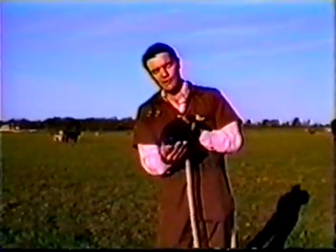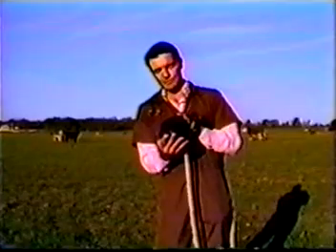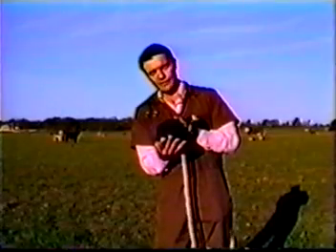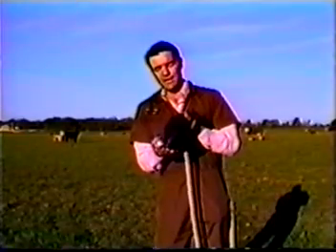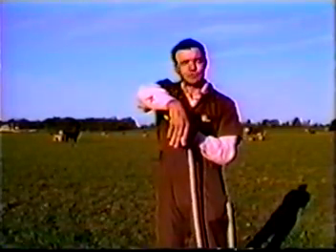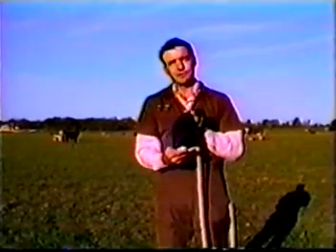Oftentimes I will put pressure upward into the gravid uterus, trying to get a little closer to the fetus. I've found that to be a very helpful tip, to put pressure upward toward the pregnancy, so as to flatten out the gravid uterus to get closer to the fetus. Sometimes that position doesn't work, and I'll come in from the side and put pressure, or I'll come over the top and put pressure back toward me, and that helps flatten. Anything to help flatten out the gravid uterus to get closer to the fetus itself is very helpful.